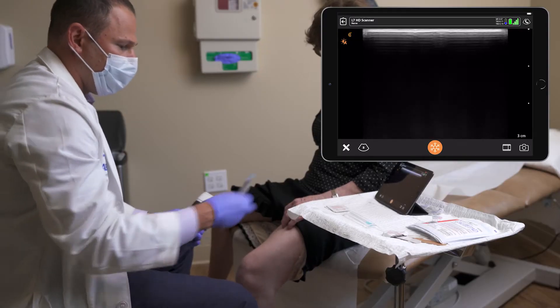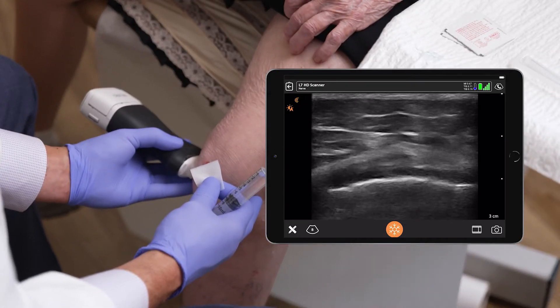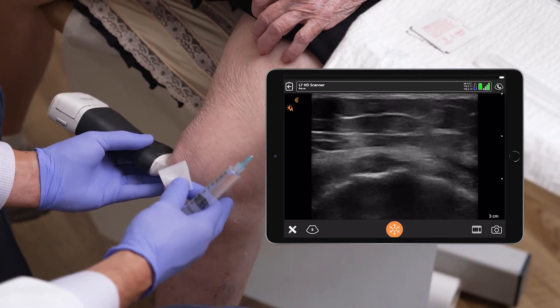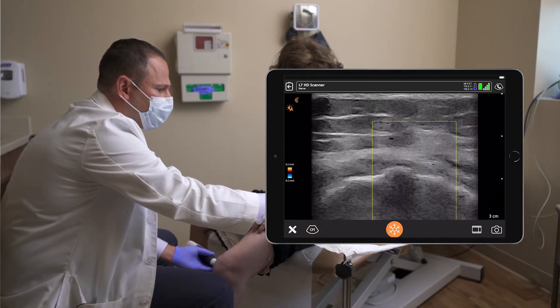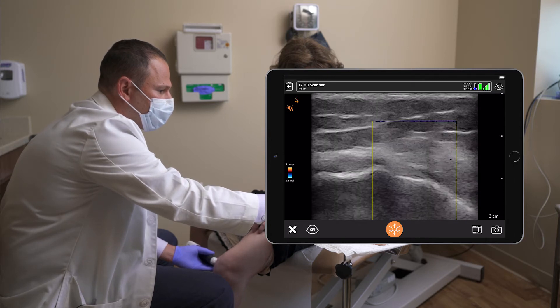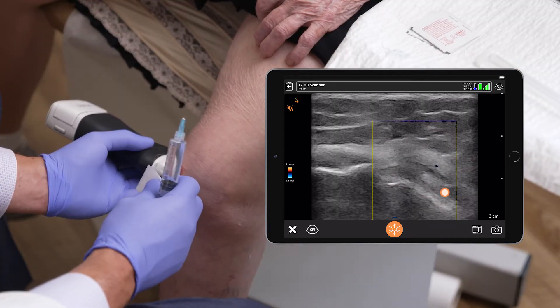Now we're going to target the inferior branch of the medial genicular nerve, going below the knee joint onto the tibia, the medial aspect. Looking for the blood vessel. It's a small nerve here, maybe difficult to find at times. It runs with a blood vessel, and superficial to the bone.